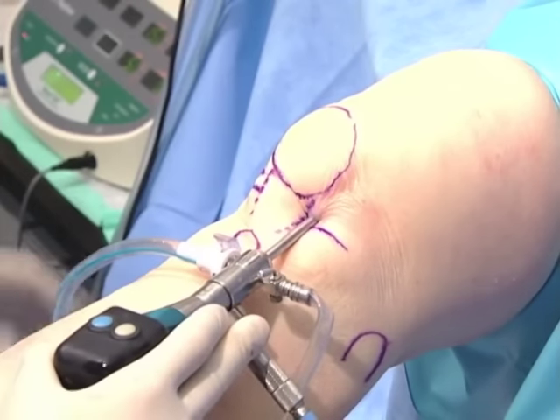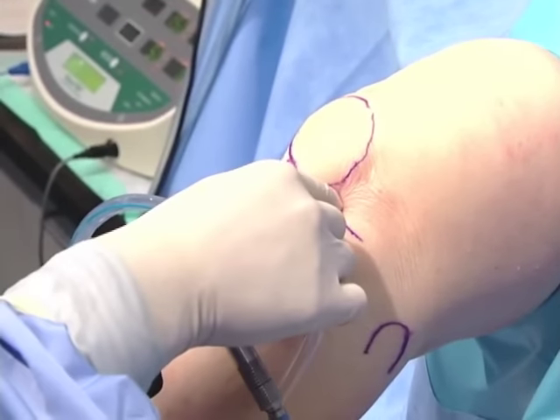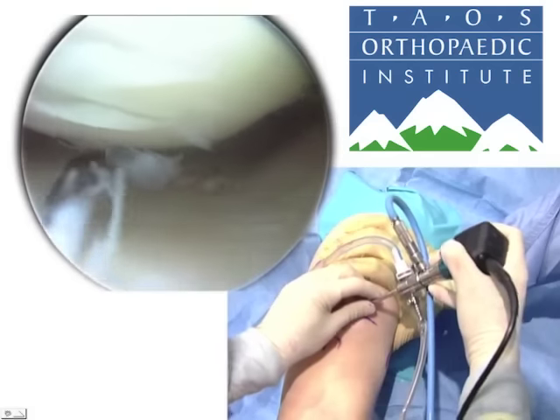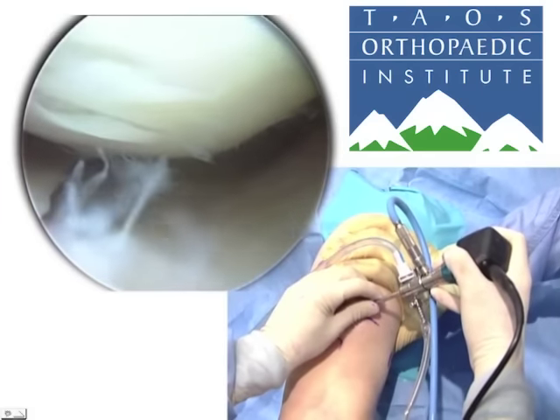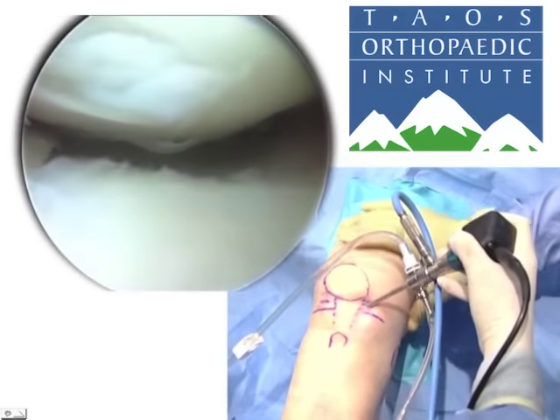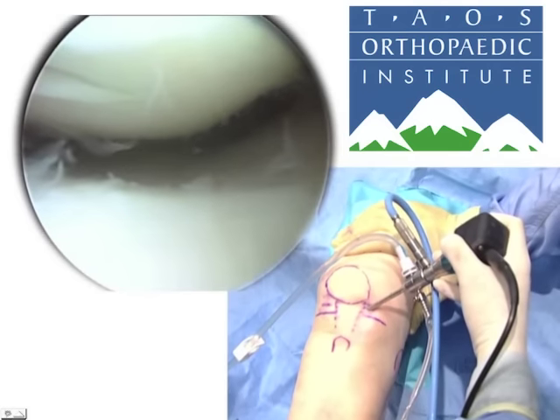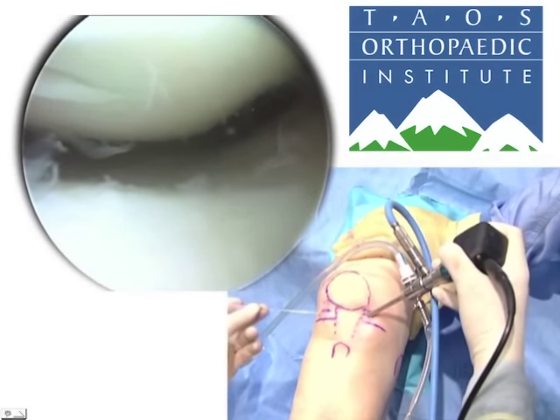We turn on our water and wait as the knee fills with fluid. I'm going to now prepare the anterior medial portal. In order to get the exact portal placement, we're going to use visualization with a camera and a spinal needle.